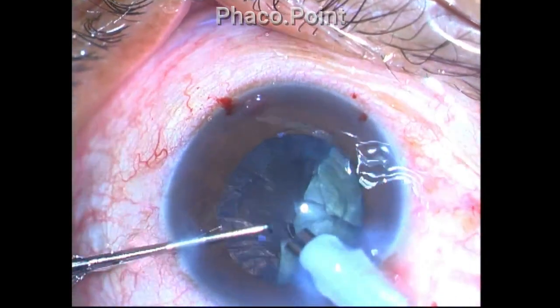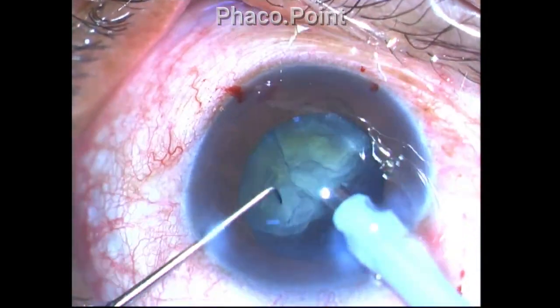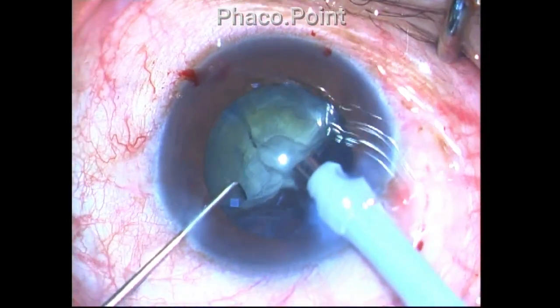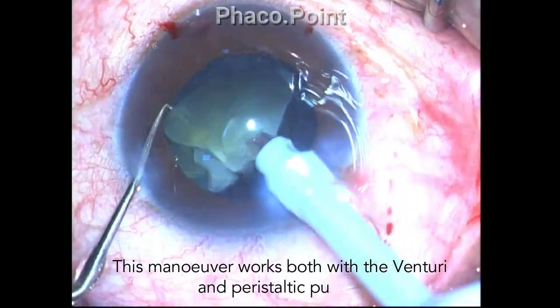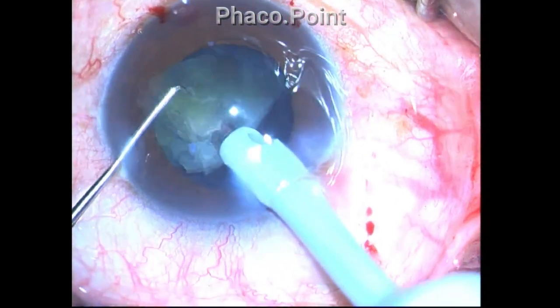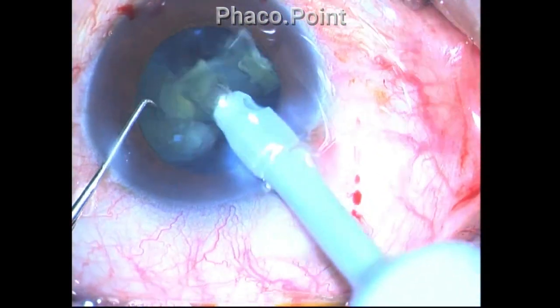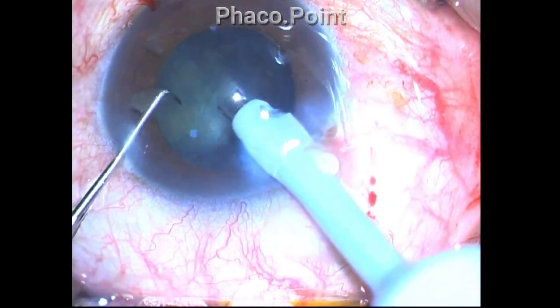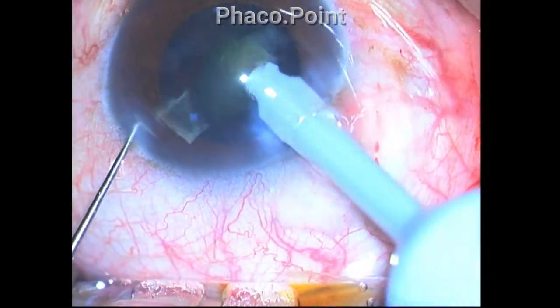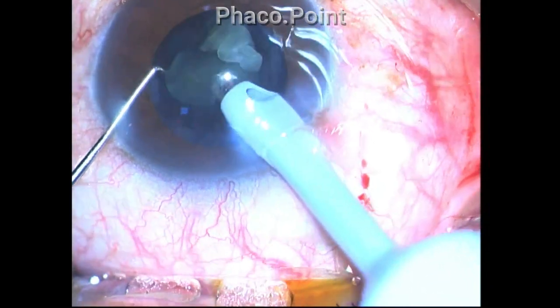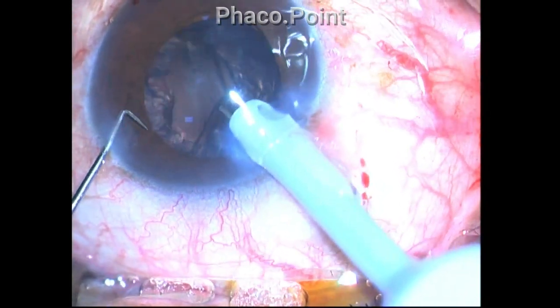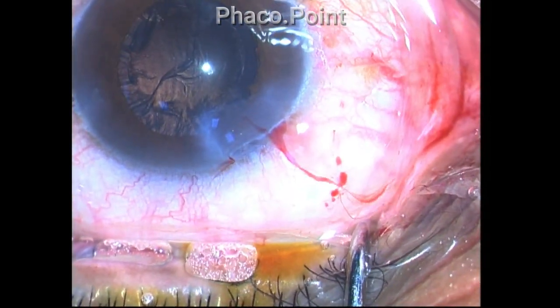But if you swivel the phaco handpiece along its long axis to about just 5 to 10 degrees on either side — not too much that you will cause iris flutter, but just a little amount of swivel — you will see that I am gently swiveling the phaco tip slightly, as you can see from the bevel face. The act of simply swiveling it will increase the followability significantly. This is because the flow dynamics will now move in different planes and help to propel the three-dimensionally located phaco pieces towards the phaco tip. This is the basis of what I call the swivel maneuver.